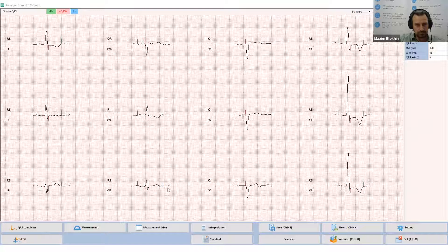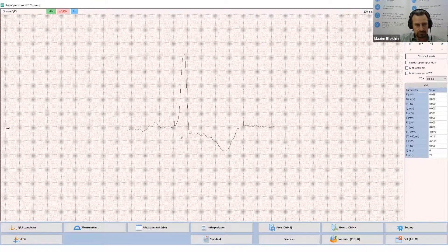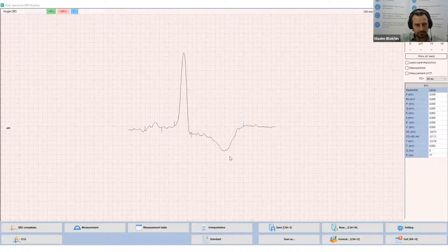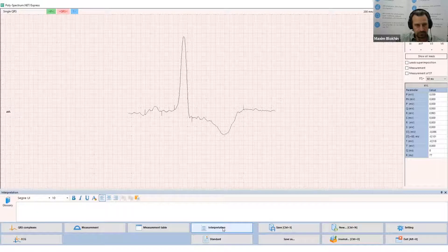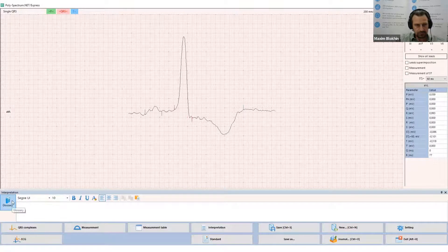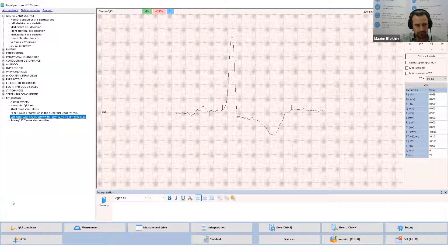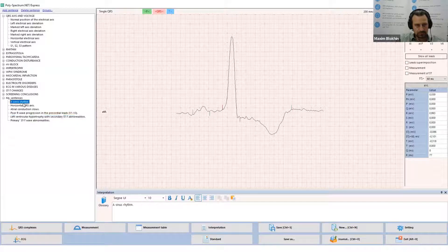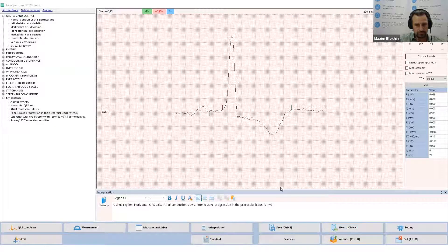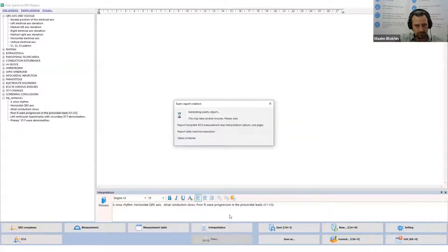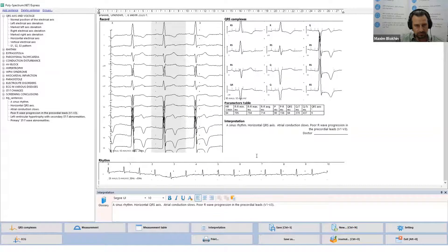For a close view, just double-click on the complex. Here you can reposition the markers manually. Now click the interpretation button — the field for interpretation text will be shown at the bottom. Click the glossary button and create the interpretation using pre-defined phrases. Then generate the report and print it out: click the standard button and the software will generate the report, then click print and the report is printed out.